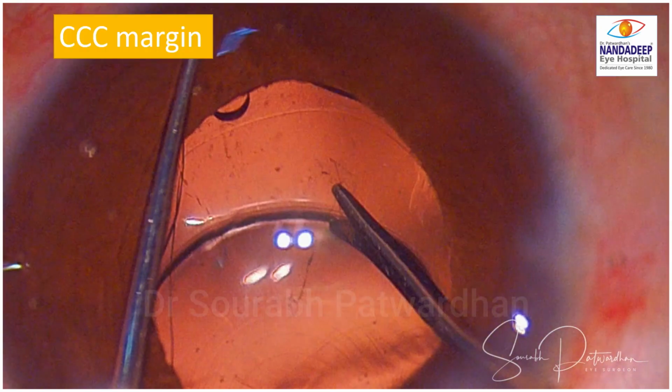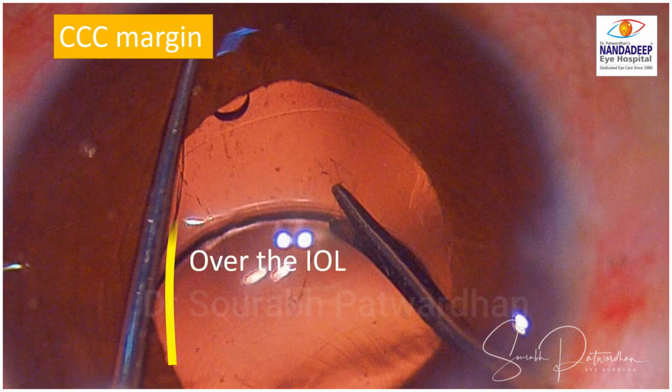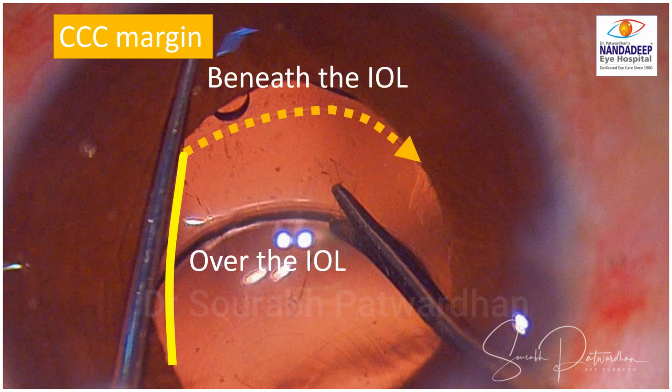So what you have to do is trace this CCC margin, and you can see that there is a part of the CCC which is above the optic over the IOL, and then it has turned almost perpendicular and gone under or beneath the IOL.